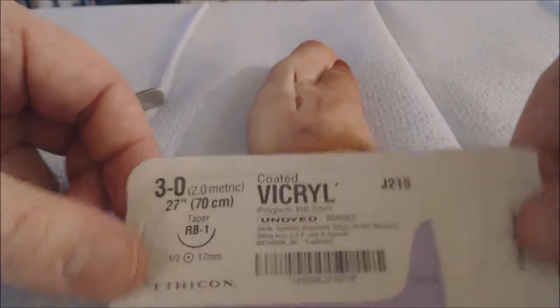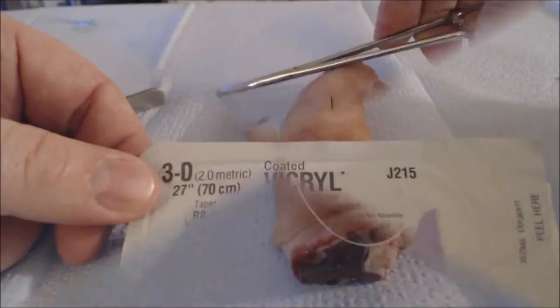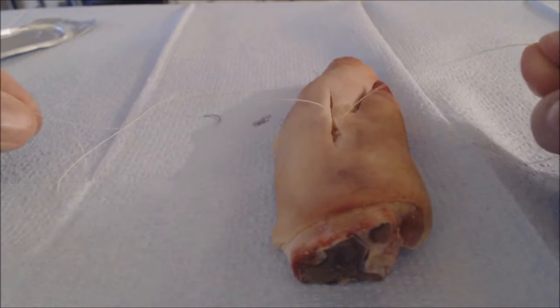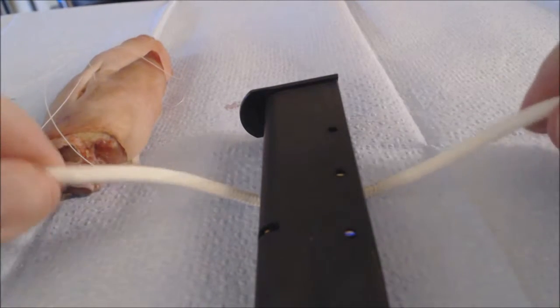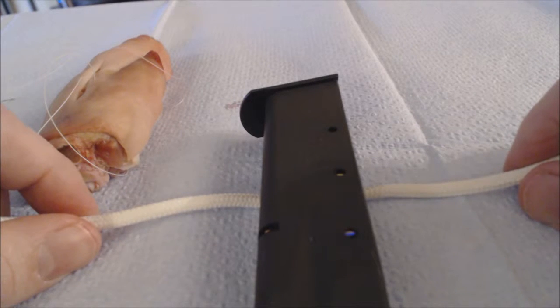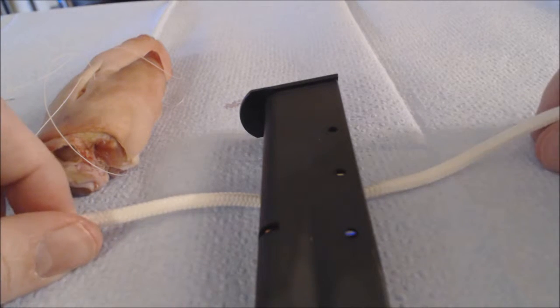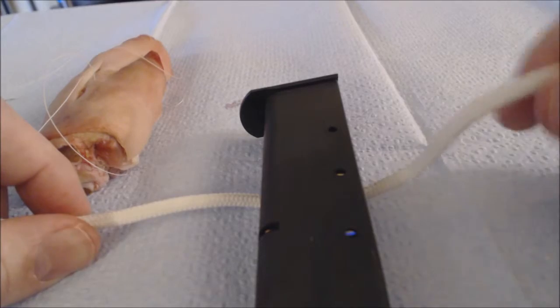We've gotten to the stage where we're ready to start sewing up our practice laceration. This video is about how to tie these ends together after you put the suture in. We've replaced our pig's foot with the practice setup used for learning the mechanics of tying knots. Here I'm using a SIG226 clip as an anchor and a shoestring.